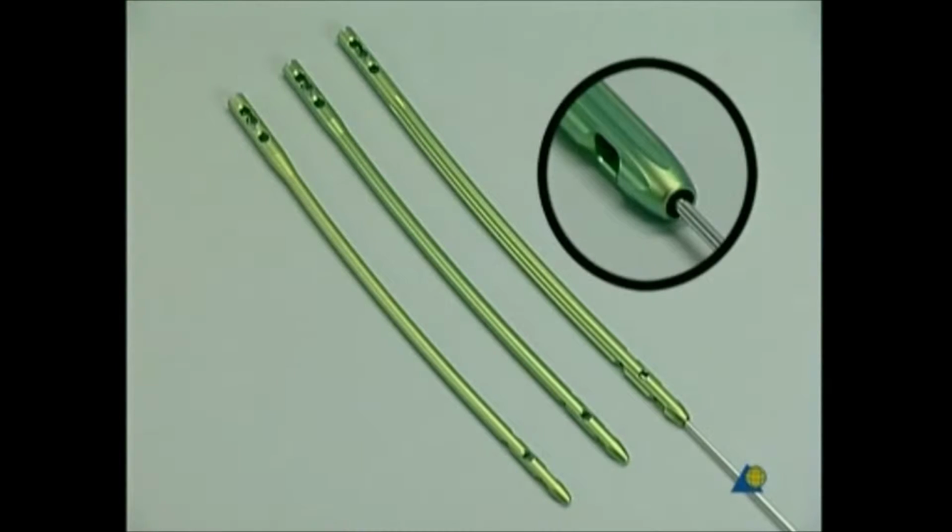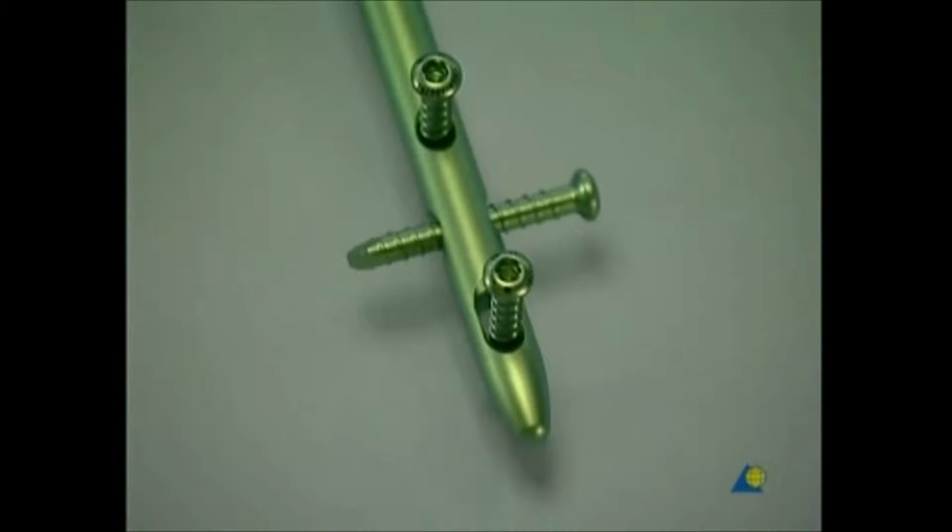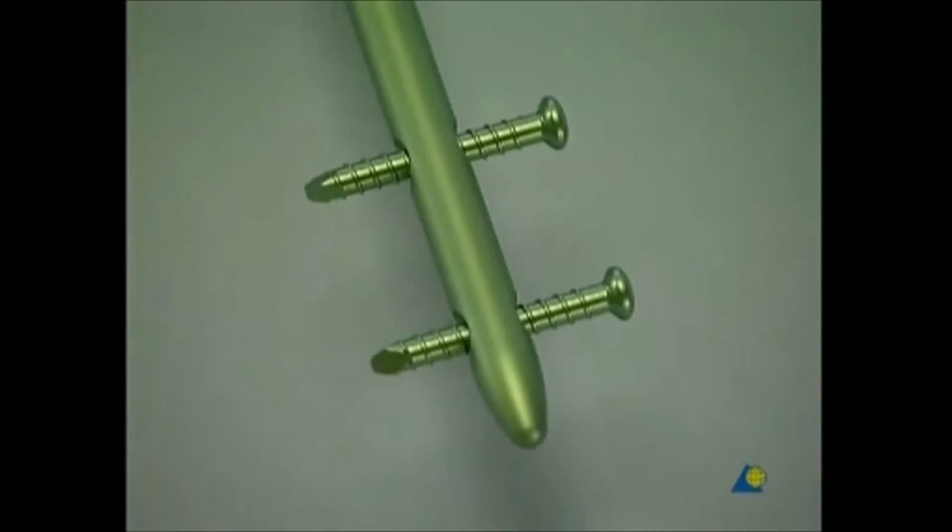Proximal locking is usually performed using 4.9 millimeter self-tapping bolts. The longer nails may be locked dynamically through an oval hole in the antero-posterior direction and or statically through a hole in the AP direction and or through a second static hole in the latero-medial direction. The shorter nails are locked proximally through static holes with two 4.9 millimeter bolts placed in the lateral to medial direction.